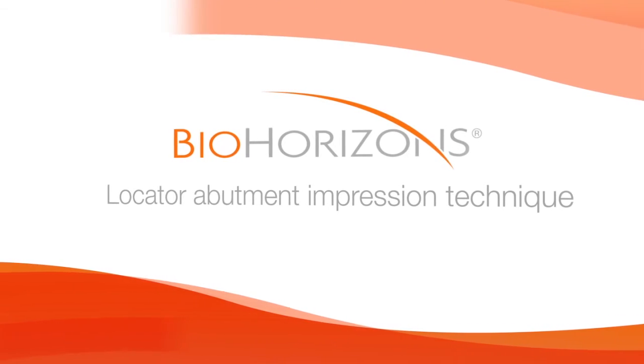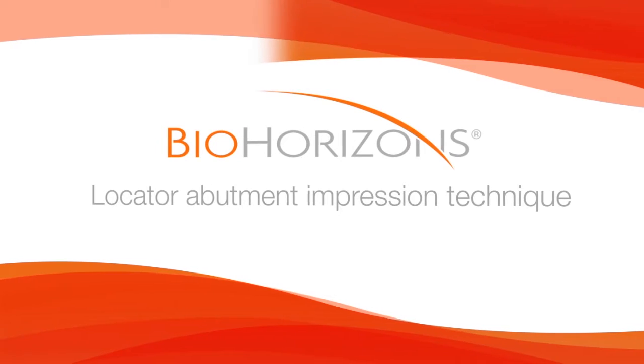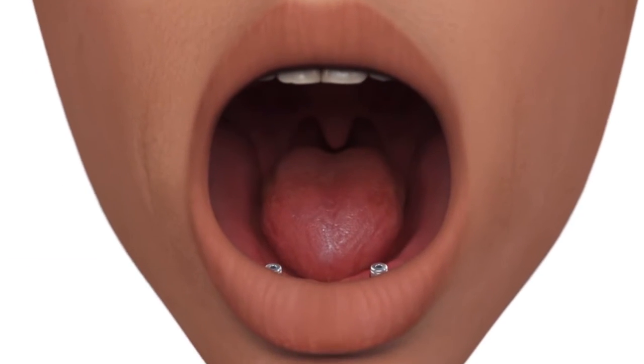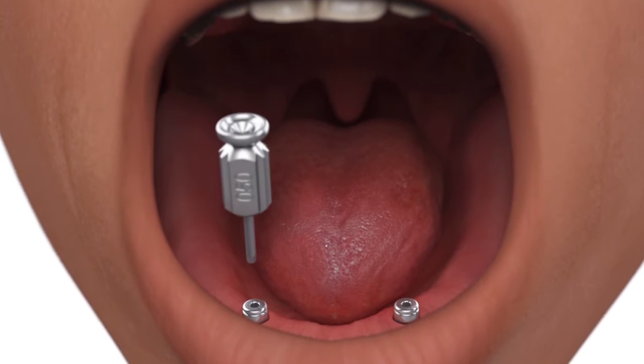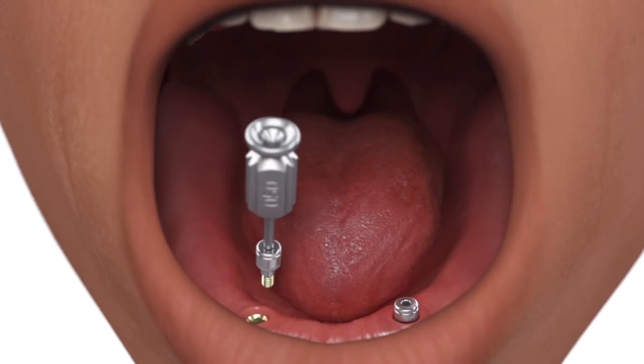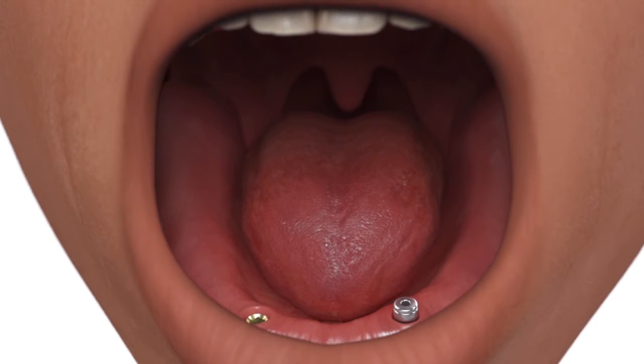Locator Abutment Impression Technique. Remove the healing abutment and confirm that the prosthetic platform is free of any bone or soft tissue debris.